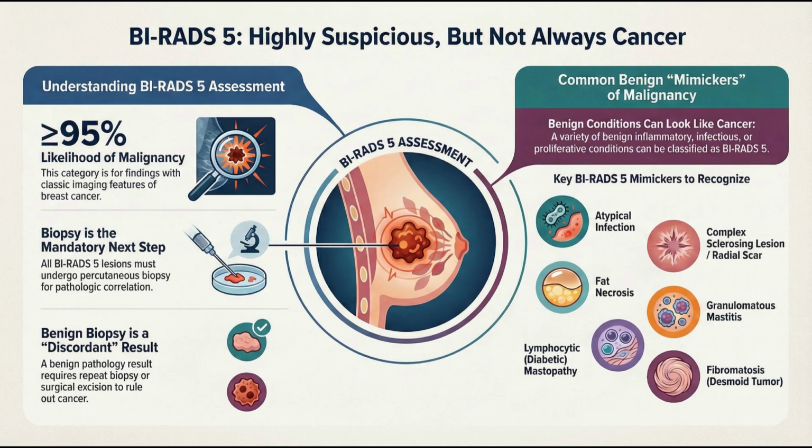Well, across all the imaging types, you're looking for signs of disorganized, aggressive growth. Let's start with mammography. The absolute classic sign is an irregular mass that has what we call a spiculated margin. Spiculated margin. Let's break that down. For someone trying to picture this, are we talking about sharp, spiky edges, like little legs reaching out from the center? Precisely. That's a perfect visual. Those spicules, those little projections, show that the lesion isn't just pushing tissue away, it's actively infiltrating it. It's invading? It's invading. That's the hallmark. We also look for things like architectural distortion, where the tissue gets all pulled and twisted, and very specific types of microcalcifications, fine, linear, branching ones.